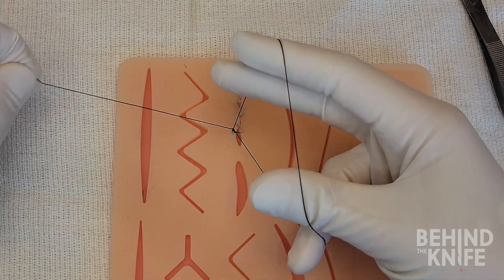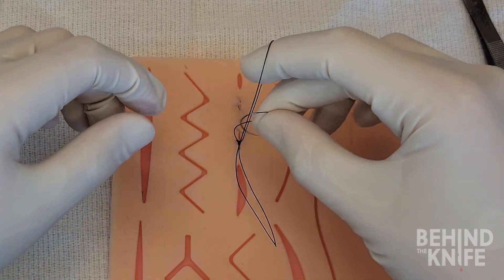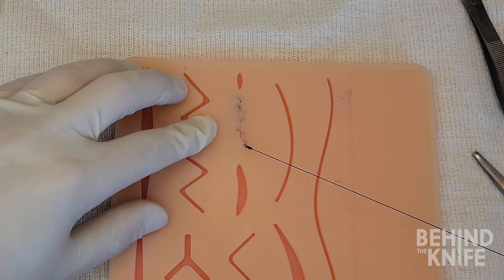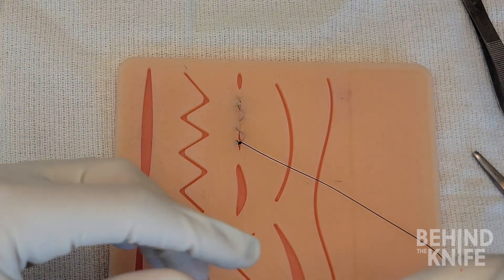On the final throw, we will pull the entire suture, including the needle, through the loop until the entire loop slides down and locks the suture in place.